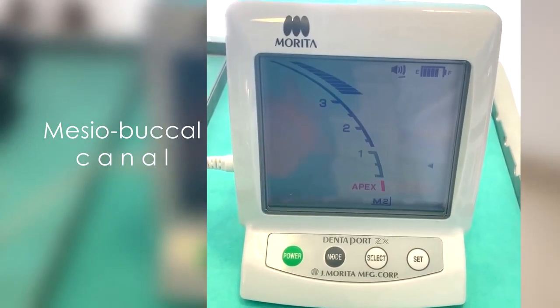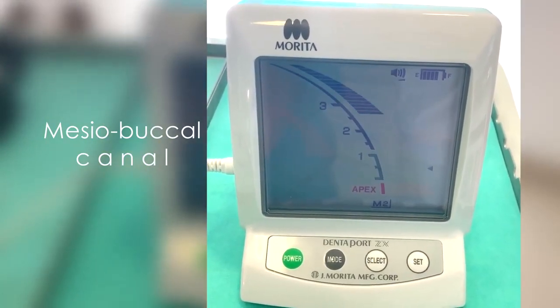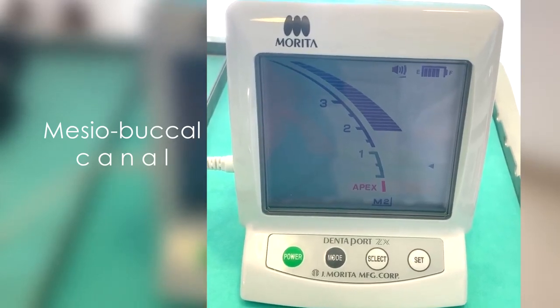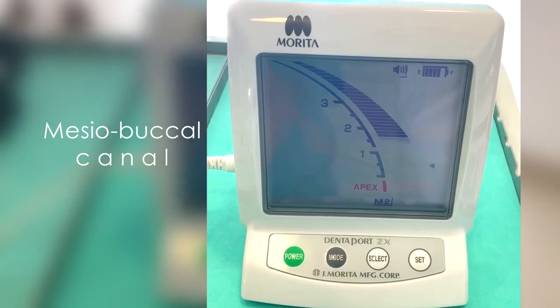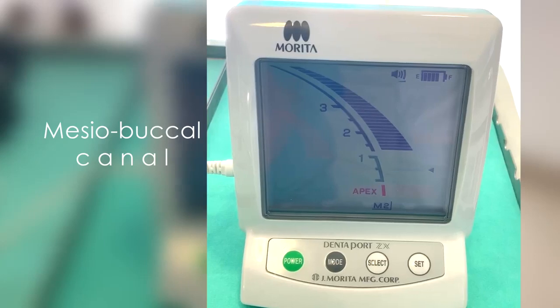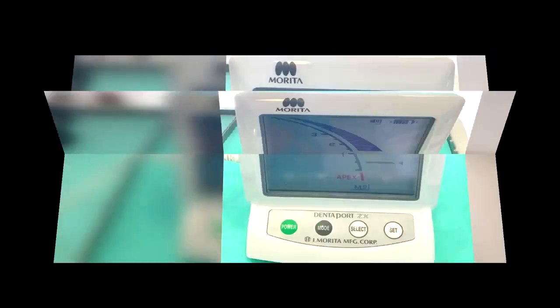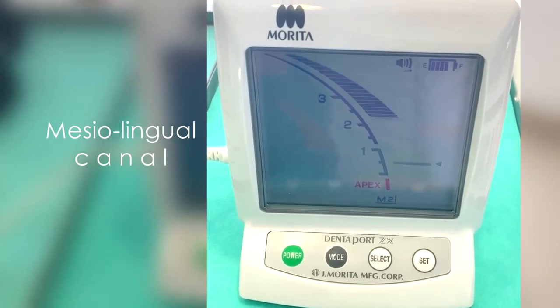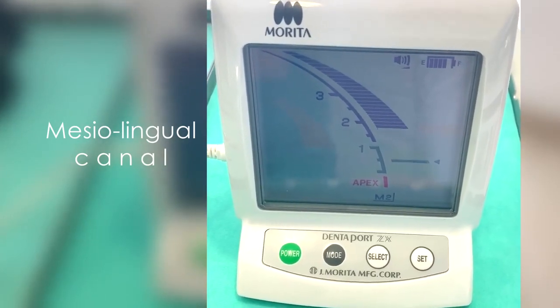With this apex locator, working length is established at the end of the blue scale. This point indicates the apical constriction or, in its absence, the point where the instrument is leaving the canal and reaching the periodontal ligament.